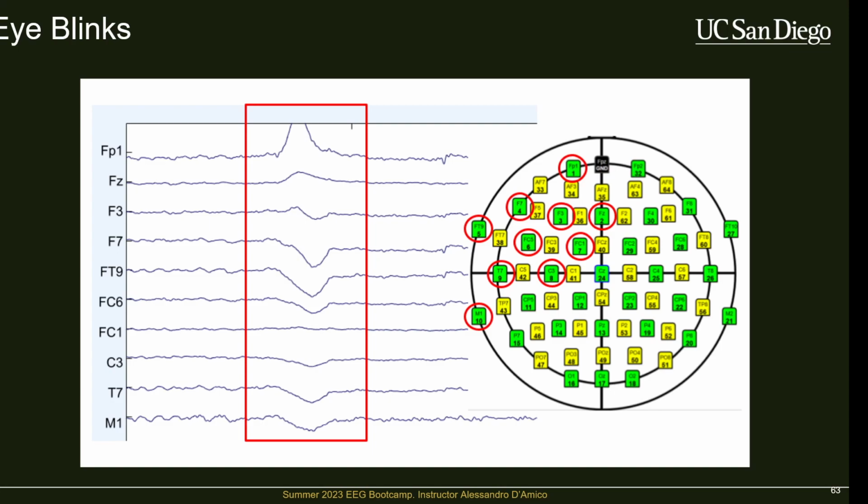Any researcher worth their eyes will just tell you that's probably a blink, and did you correct for your blinks? And if the answer is no, then you're doing bad science. It's a very contrived example, but you'd be surprised how many things like this actually happen. Not all artifacts or systematic conditions are that easy to spot, which is why we want to be very careful.